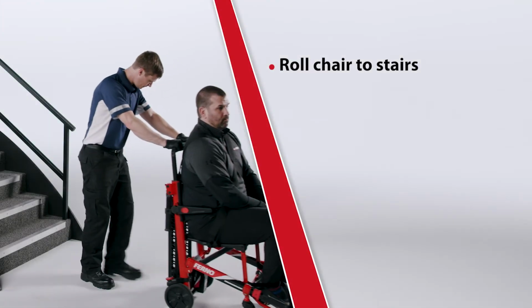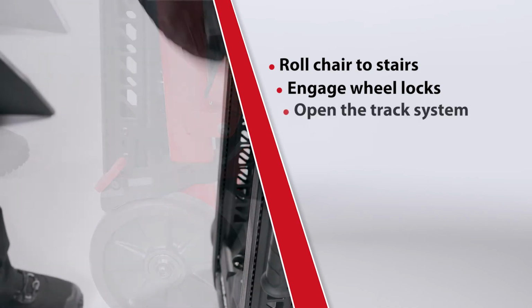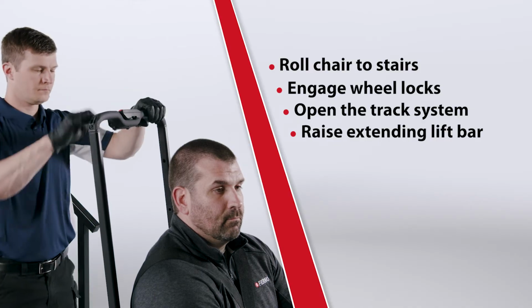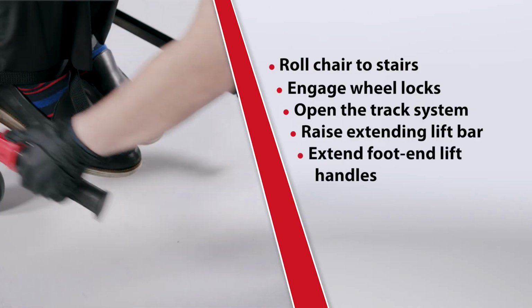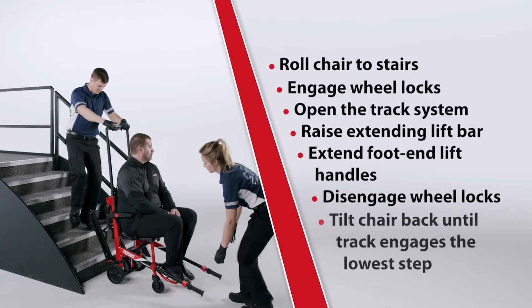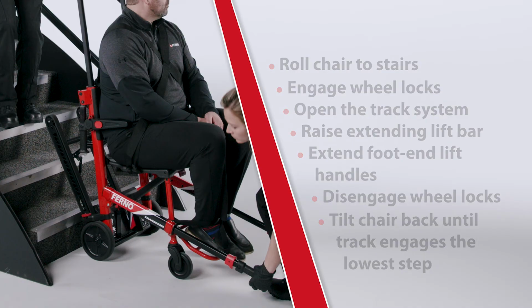Roll the chair to the bottom of the stairs and engage the wheel locks. Open the track system and verify it is locked. Raise the extending lift bar. Extend the foot end lift handles. Disengage the wheel locks and tilt the chair back until the track belts touch the edge of the lowest step.